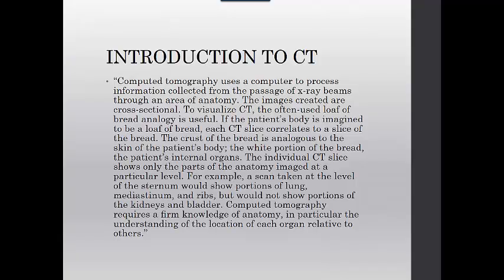So let's start this lecture with a definition of computed tomography. It comes straight out of our Romans book. Computed tomography uses a computer to process information collected from the passage of X-ray beams through an area of anatomy. The images created are cross-sectional.